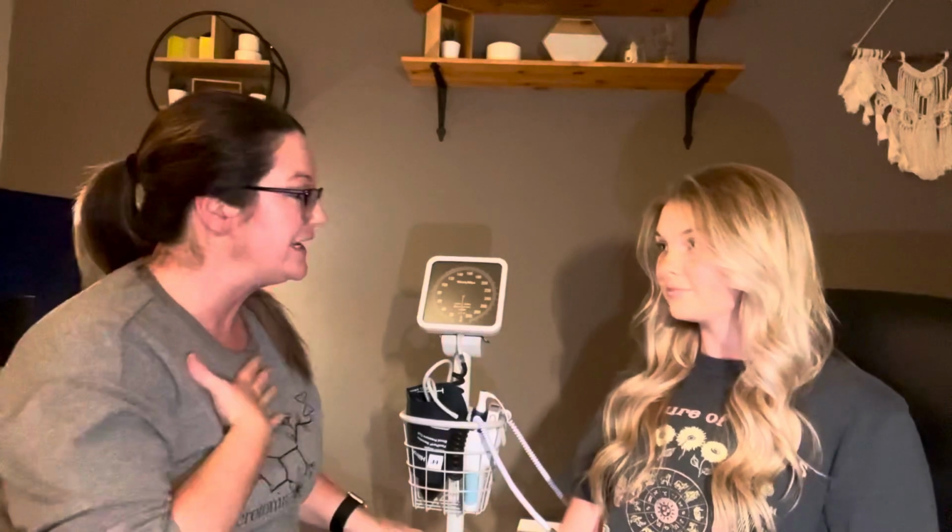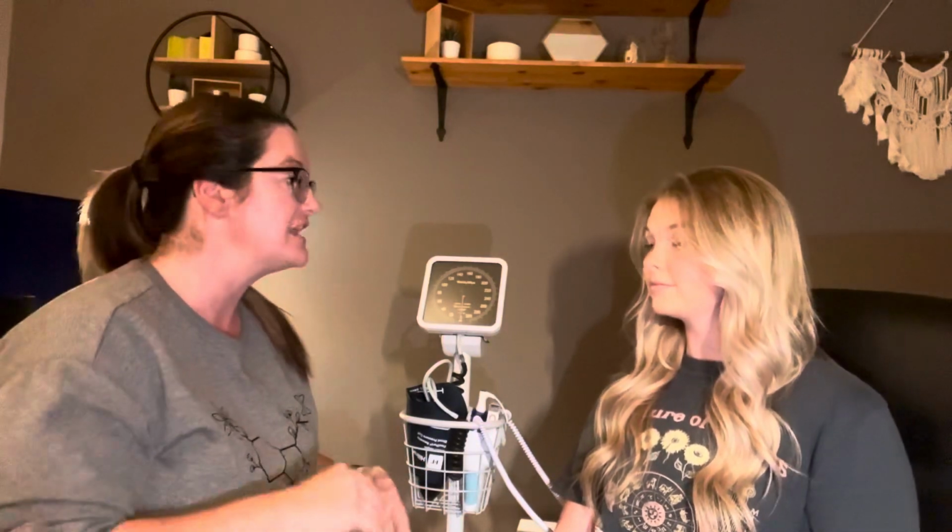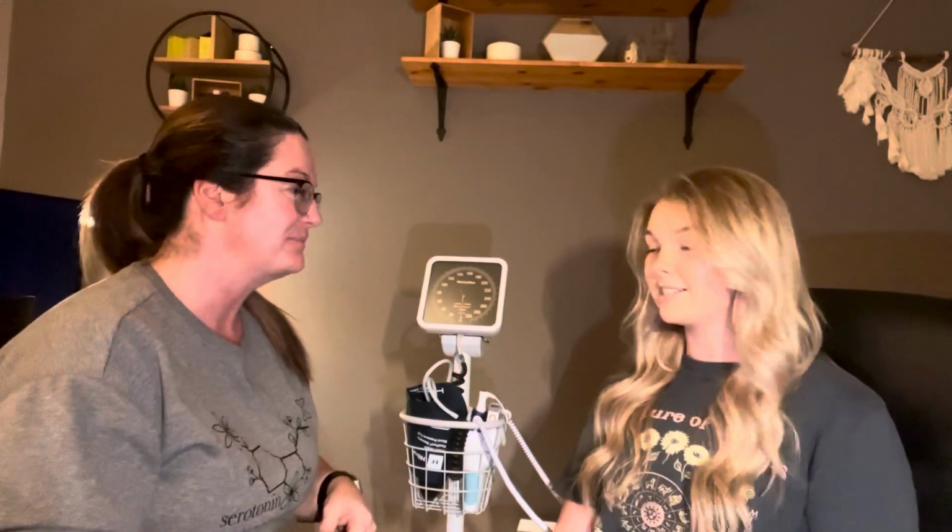All right, so we're gonna start with a temperature. I'm gonna go in and introduce myself. So hi Mariah, my name's Connie. I'm gonna be your nurse today and I'm here to get a set of vital signs. So that's gonna include your temperature, respirations, pulse, and blood pressure. Is that okay? Yes. All right.